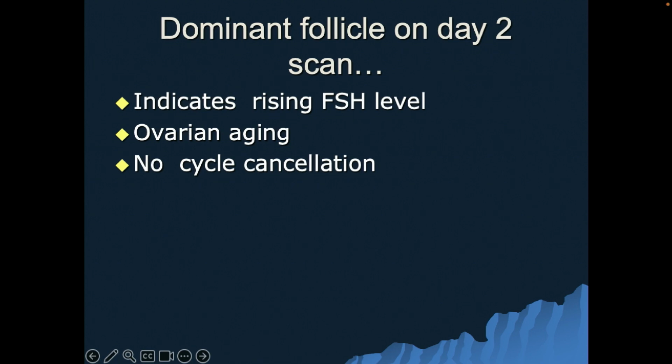Why would there be a residual follicle of the previous cycle? Because in the previous cycle, when the surge came, there were 2 or 3 follicles which were still in the growing phase, mid-size. So they remain as growing follicles even in the next cycle sometimes. They don't regress with the menstruation, they may remain there. Whatever is the cystic lesion, put on the Doppler. If you see blood flow, only then it is hormonally active. So this regressing follicle will show scanty flow, and if it is there, it is high resistance. Even if it is a follicular cyst, it will show scanty flow and it is high resistance. But if it shows no flow at all, most of the time it is a simple cyst.